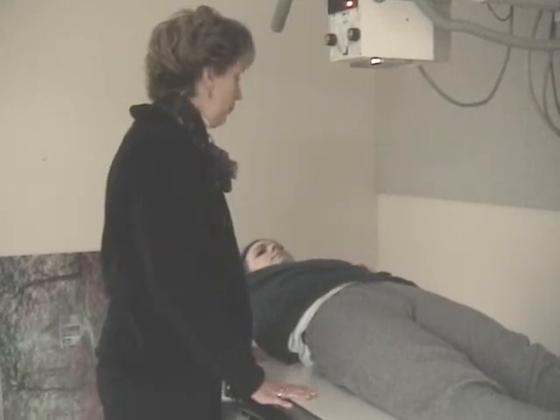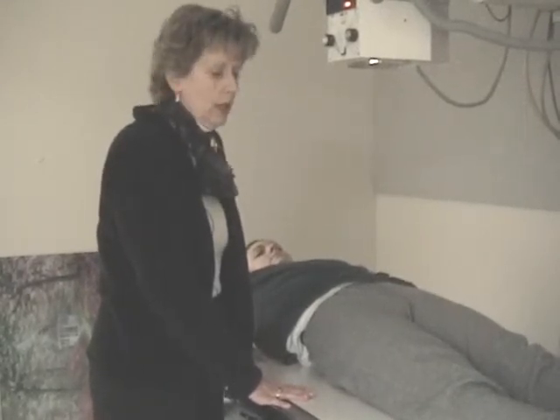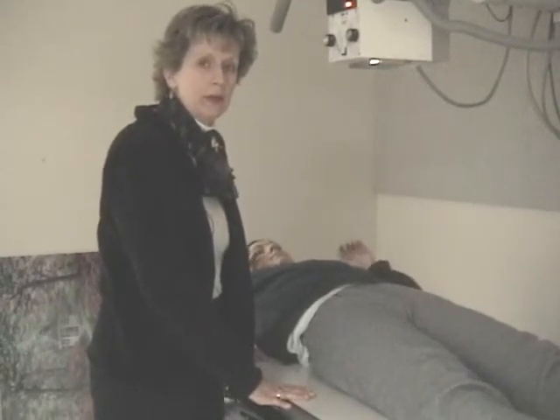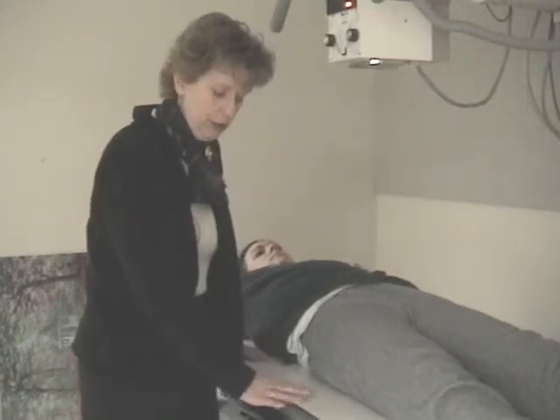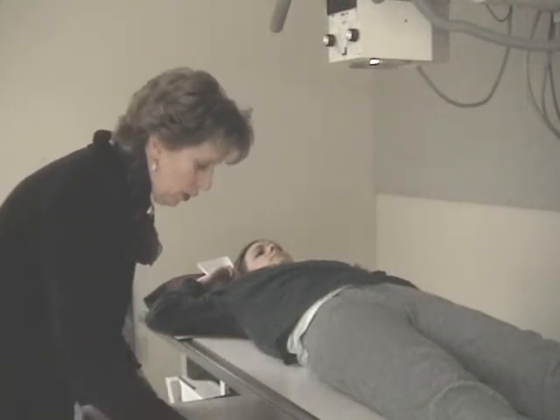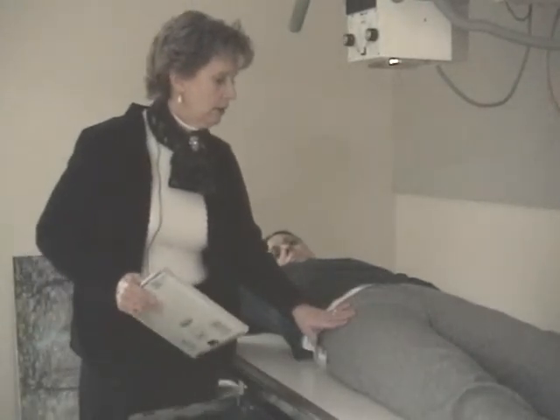The patient would take in a breath in and blow the breath out before you make your exposure. Okay. Once you take your AP pelvis, you will do one of two laterals, a frog leg or a cross table. I will demonstrate the frog leg first. We're focusing right now on the hip, which consists of the acetabulum, the head, the neck, shaft of the femur and the greater and the lesser trochanters.